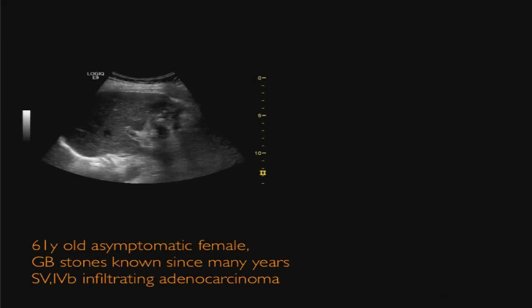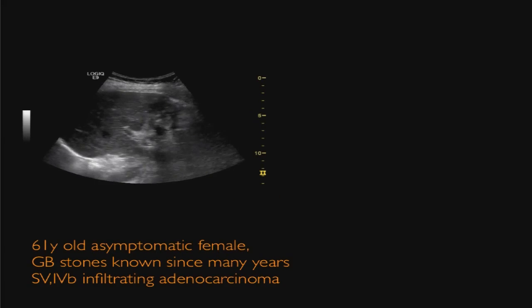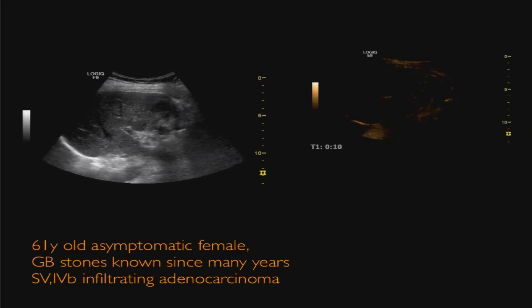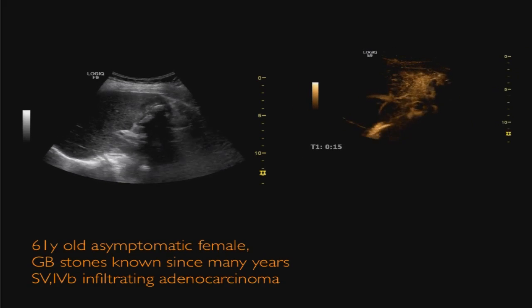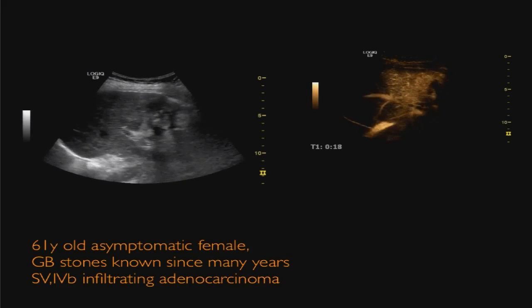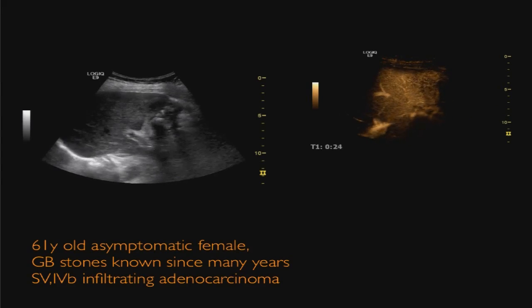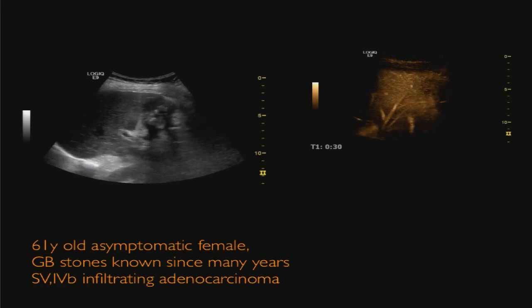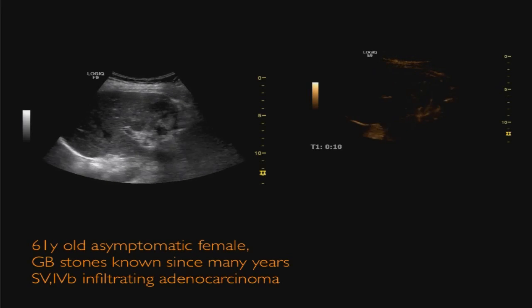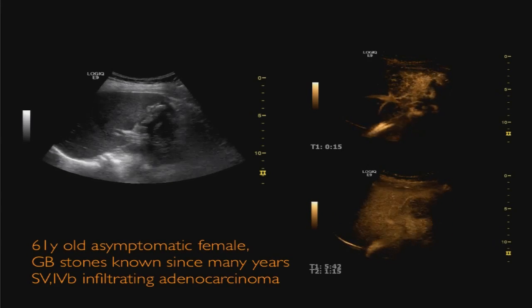So this is a 61-year-old patient with gallbladder stones for many, many years. She didn't know how long, but she says it's more than 20 years. And this was the grayscale image. And when you give contrast, you can see not only that the tumor is enhancing, but you can also see the infiltration of the adjacent liver. This is, of course, important for the surgical management of this patient. And you can see it's now washing out. And the washout zone is smaller than the hyper-enhanced zone that we saw first. So that's the same story as what you saw with the liver metastasis before. Okay, and this is the late phase.